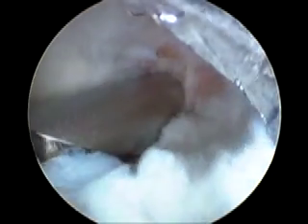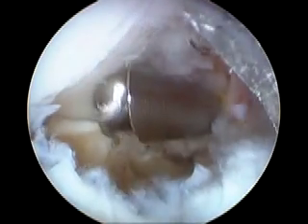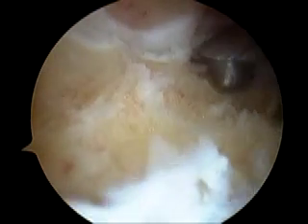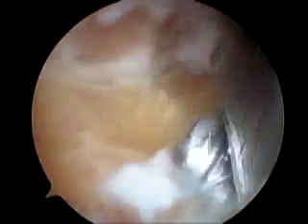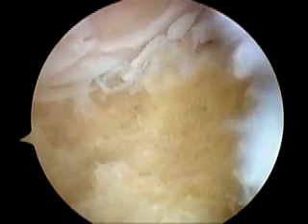Now we are starting from the lateral portal to resect all of the radial head, and once the radial head was fully resected, we could resect a little part of the capitulum if necessary, and it was. So now we are taking a little part of the capitulum in order to make resection of the radial head easier, and still removing a lot of bone since we were doing it arthroscopically. We had to pronate and supinate the forearm, as we are seeing now, to make resection easier.